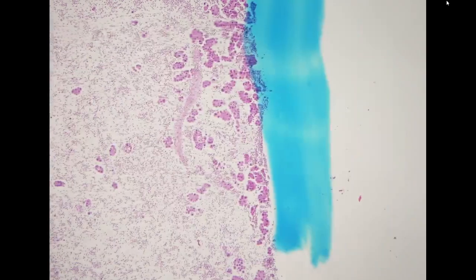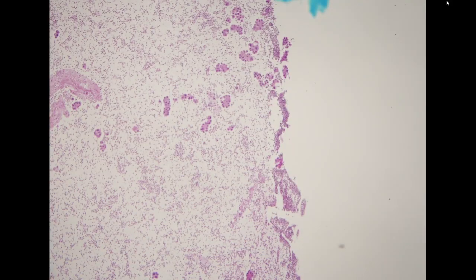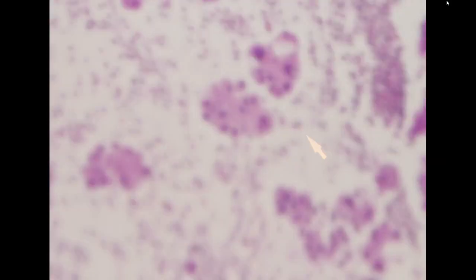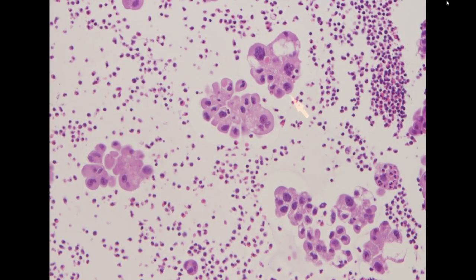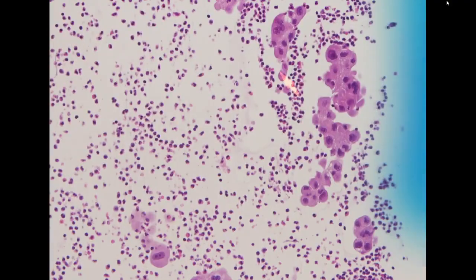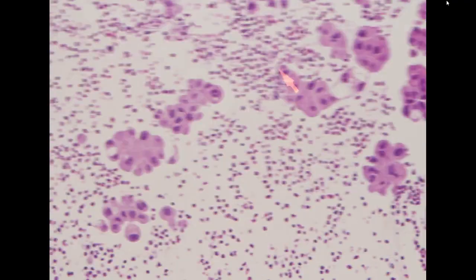I just want to show the cell block preparation of a typical lung cancer. It looks like this. You will see small but tight clusters of glandular cells. It is common that you can see a peripheral cleft, which suggests an artificial cleft, but when it is present, it highly suggests that this cluster is metastatic adenocarcinoma. So this is the typical morphology in the cell block preparation.